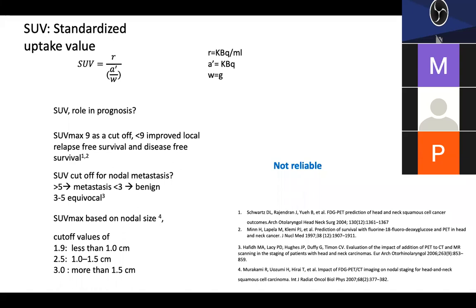Correct. And what would you advise, an MRI or a PET-CT for doubtful prevertebral fascia involvement? MRI. If there is a doubt, ma'am, MRI. Because MRI also overestimates the prevertebral fascia involvement. But MRI might overestimate, obviously, whereas in a CECT the soft tissue discrimination is very bad. Many times we will not be able to comment unless it is very obvious. So the take home message would be, for doubtful prevertebral fascia involvement, MRI is the imaging of choice.